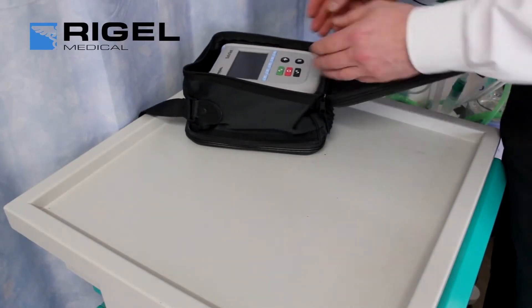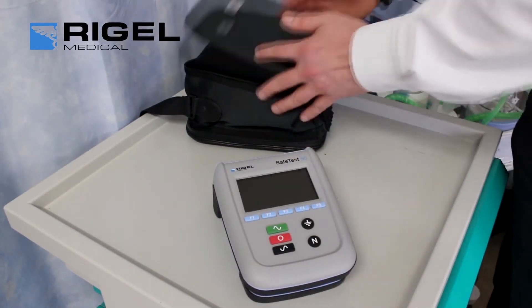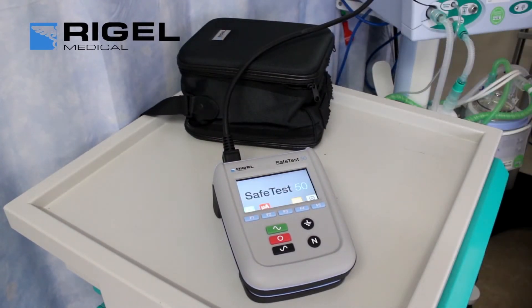The SafeTest50 from Rigel Medical is an entry-level safety analyzer. It is designed for testing medical devices that do not require patient-lead testing, as well as laboratory equipment in accordance with international safety standards.